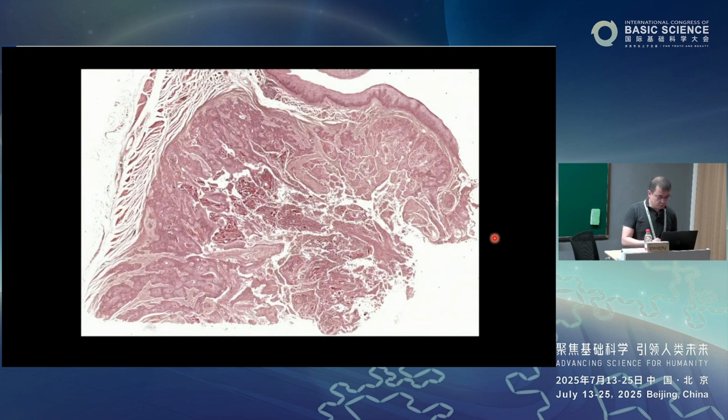What I want to show you here is a video of the images we recover. These are pathology sections typically used for medical diagnosis. The gold standard is that the doctor needs to take some tissue samples from the patient, put them on top of glass, and image this section to figure out the type of disease of the patient.